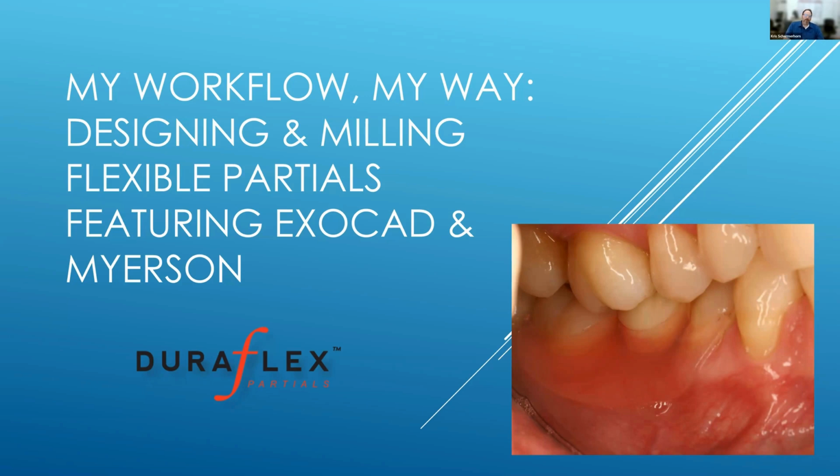And so what I'm going to talk about today is digitally designing DuraFlex flexible partials. And flexible partials have their place in the industry. And a lot of people don't necessarily like working on flexibles done the traditional way. Now you get good at them. They can go smooth and they can be as close to as easy as doing it as you would an acrylic partial. But you've got to spend the time to get good at it. And doing things the analog way takes time.